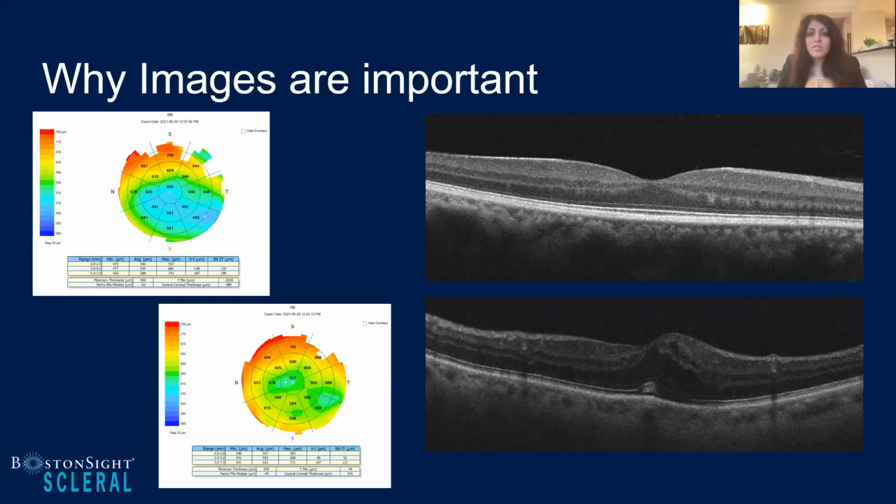It reinforces my reason for always checking the retina, because even though we are corneal specialists dealing with scleral lens fitting, the eye is a structure that has so many components to it that we need to not forget about the other parts of the eye. This guy was unfortunate that we had 2 episodes of edema at 2 different locations. I'm happy to say now he's doing really well, and he's well adjusted to his lenses, and we've got him all sorted out.